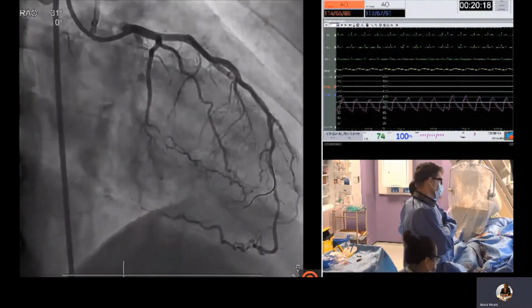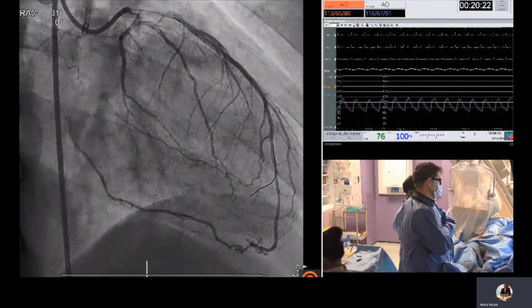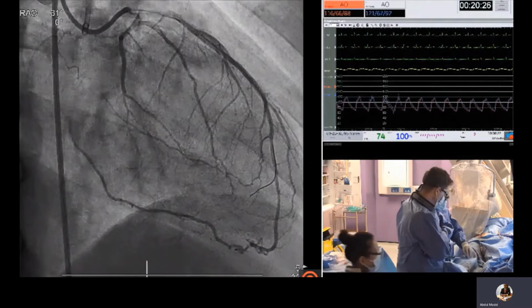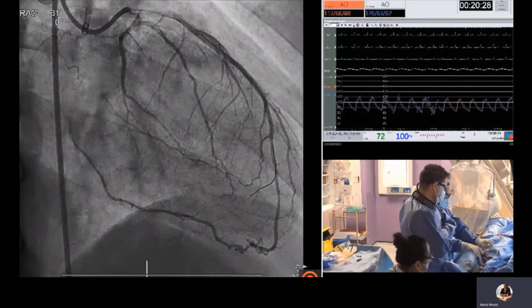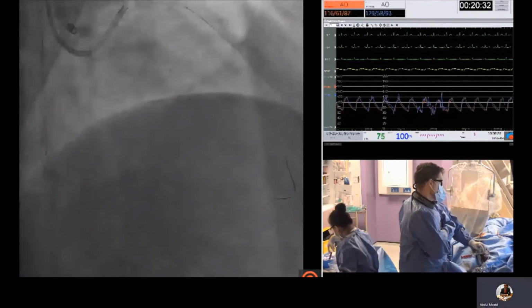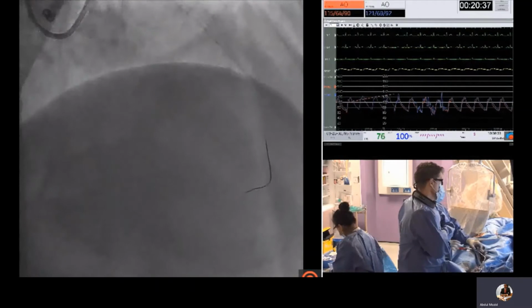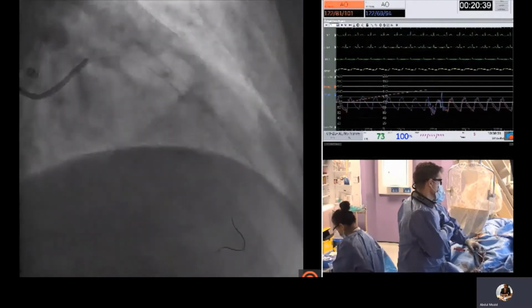So here are the setup images again. There is a dominant apical collateral from the LAD, which is highly tortuous, but potentially usable. But as always, we try and at least attempt the septals first, as these are much safer.